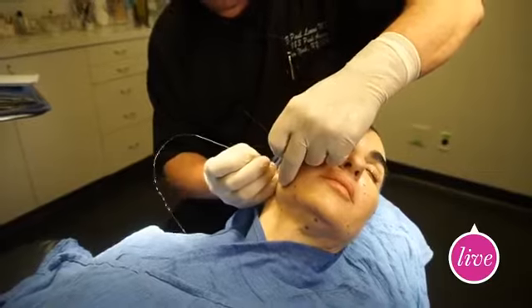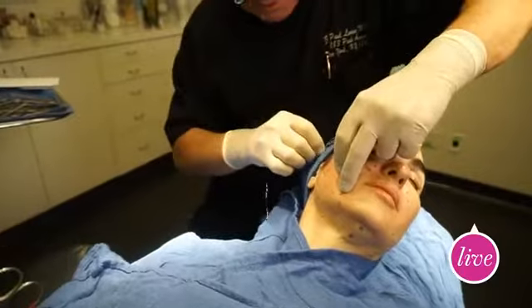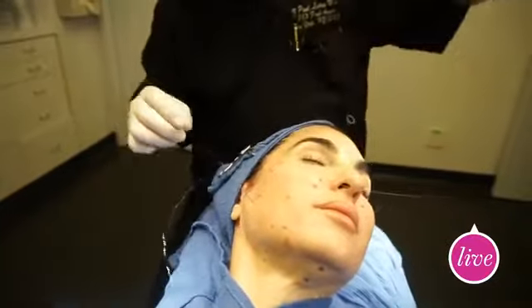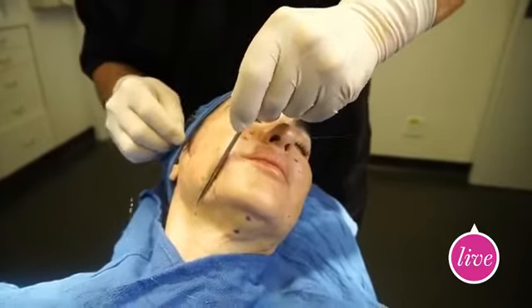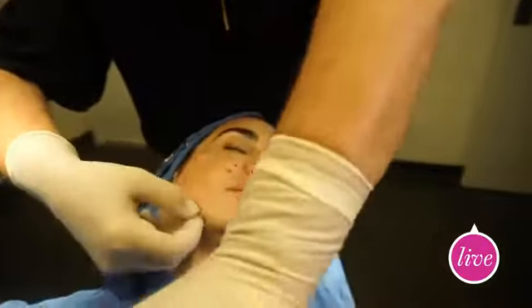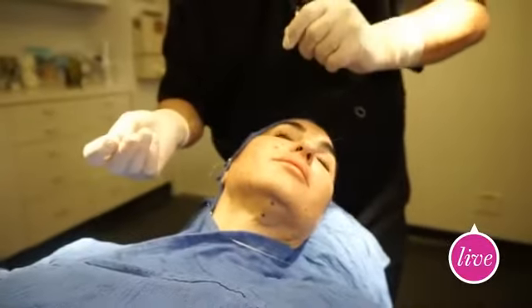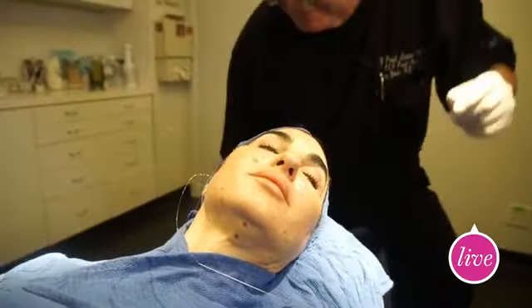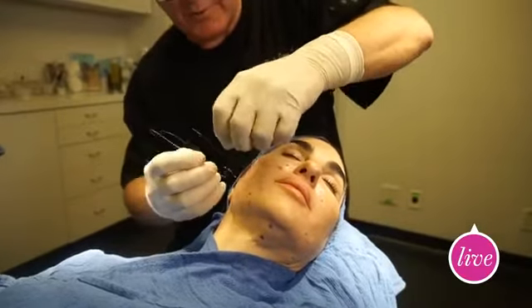Now, everyone wants to know what is the biggest safety concern for this. I know you mentioned infection. Is there anything else? No, I mean, infection, again, very, very rare. This is a placement above all the facial nerves, so it's very unlikely that you can have injury to the facial nerve. We have just not seen it. Anything theoretically is possible. But you see how easily it just drops right in. And overall, it's a very, very safe procedure. And as you can see, done under local, patient is comfortable.